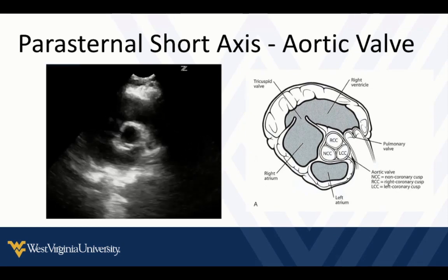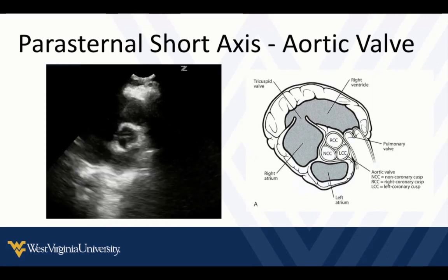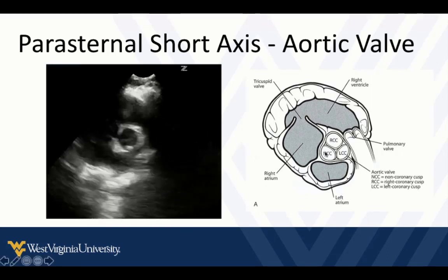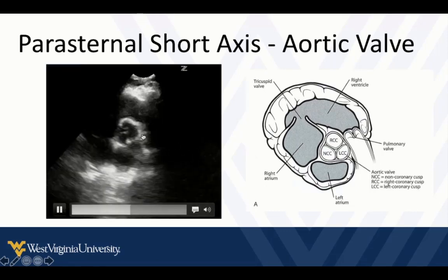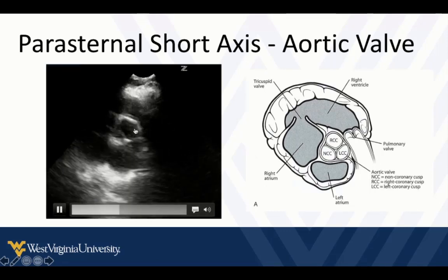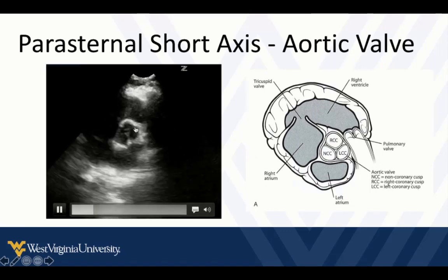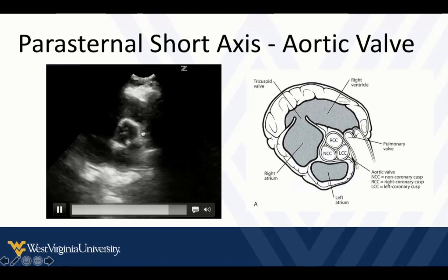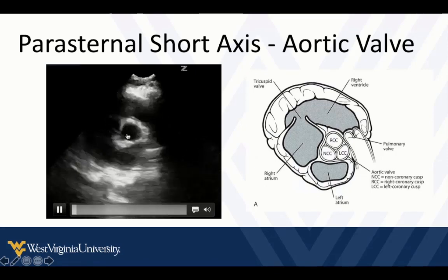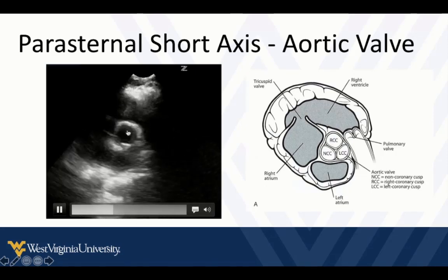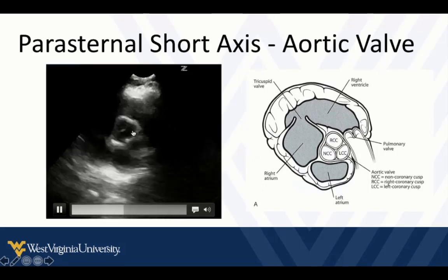If we slide or fan the probe a little bit closer to the sternum, we make a slice along the base of the heart where the aortic valve is our focal point. Compared to the mitral valve, the aortic valve has a smaller diameter and a more dense outline. If we get a really nice view, we can see all three cusps and the little Mercedes-Benz sign of the aortic valve.